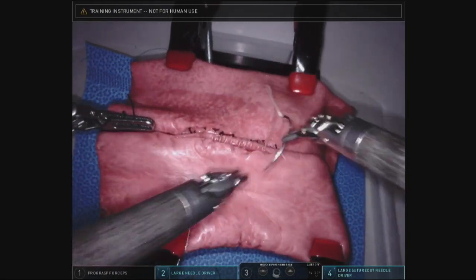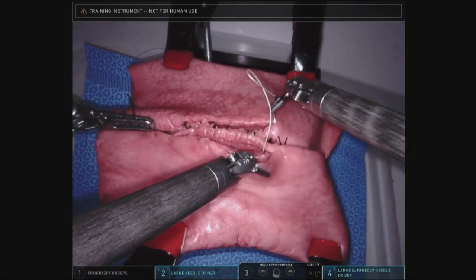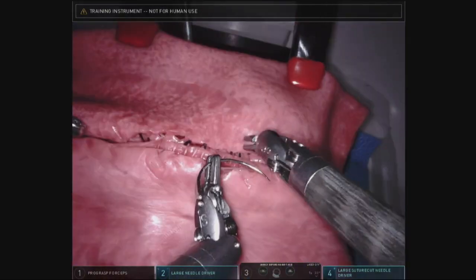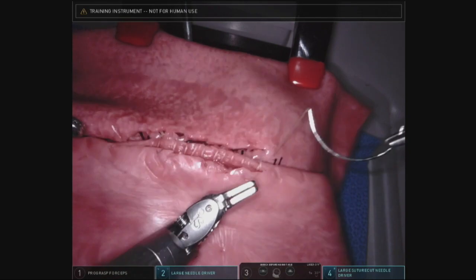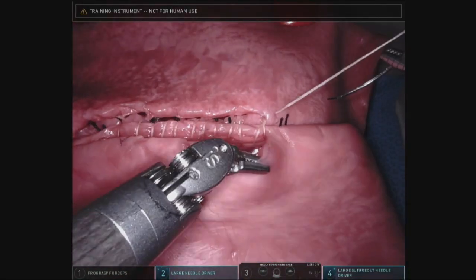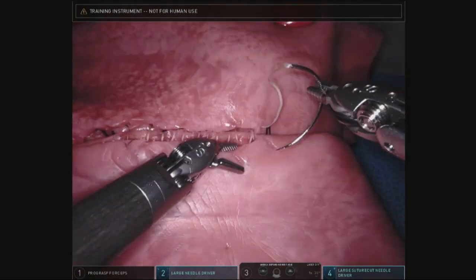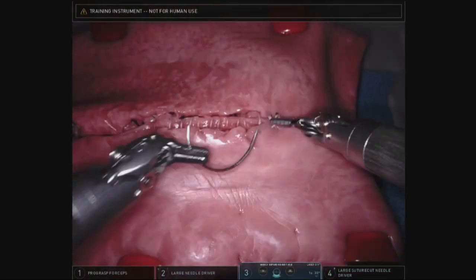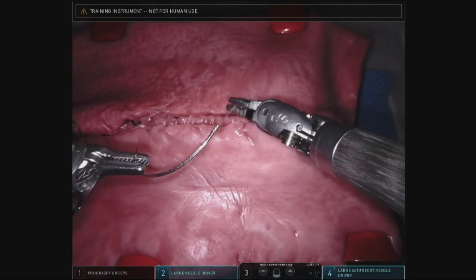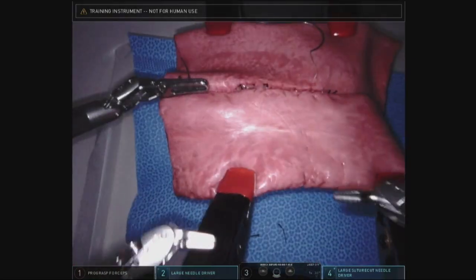So continue simple running sutures until the corner. And once you've rounded the corner, as you can see for the anterior wall, we're going to do a Connell stitch. I'm going to start a Connell here. I'm getting short on my stitch, so I'm going to start the next one.